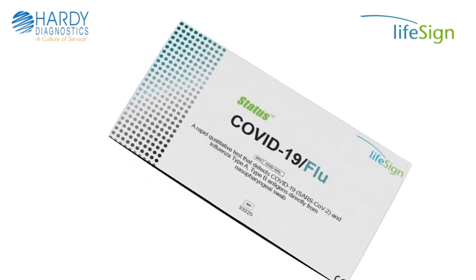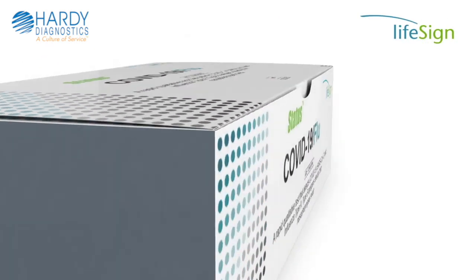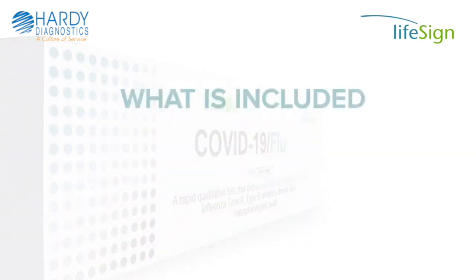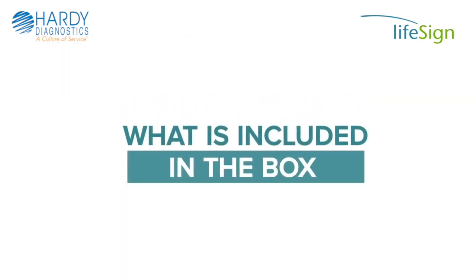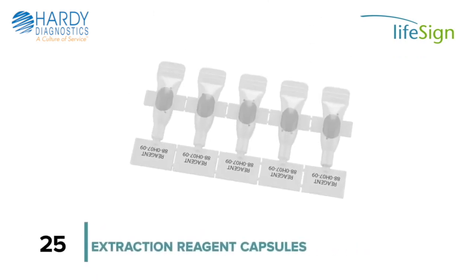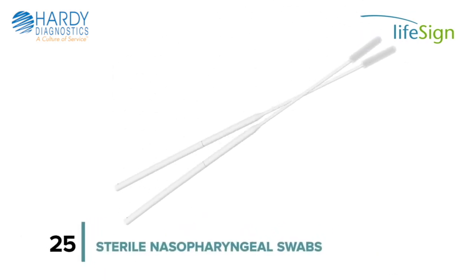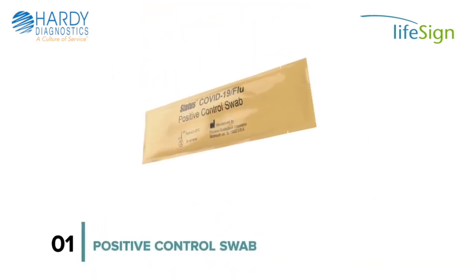Each Status COVID-19 Flu A&B Test Kit comes with enough reagents and materials for 25 tests. The following components are included: 25 Status COVID-19 Flu A&B Test Devices, 25 Extraction Reagent Capsules, and 25 Sterile Swabs.